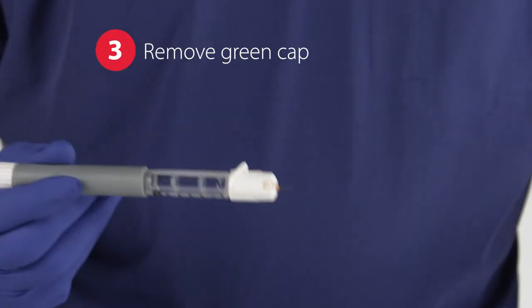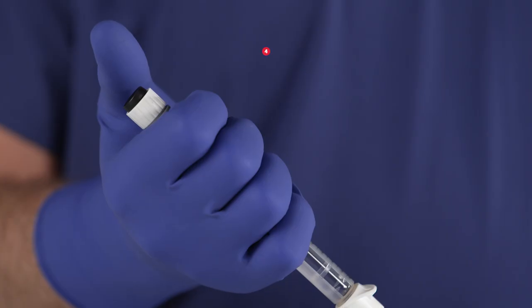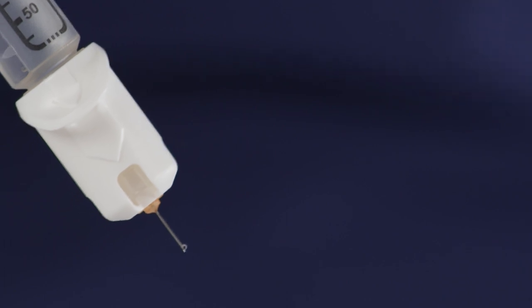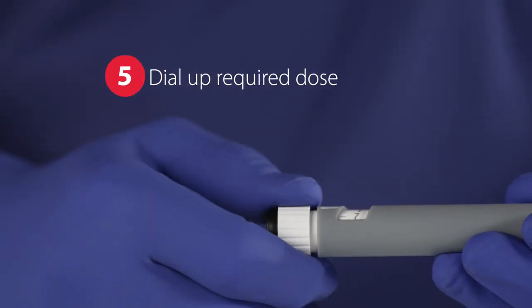Remove the green protective cap to reveal the needle. Prime the pen injector to remove any air by following the pen manufacturer's instructions for use. Dial up your patient's required dose of insulin.